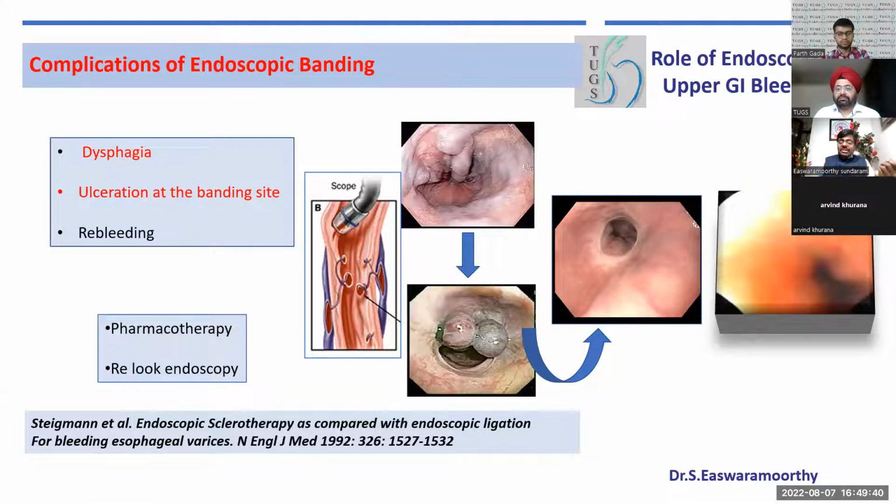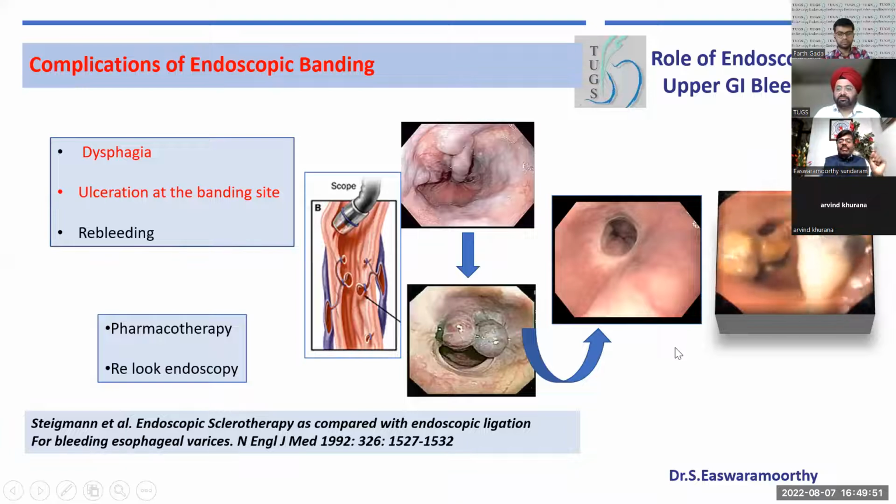Even the patients ask, sometimes GPs ask, they have to know: after 48 hours, the bands slough off. Okay, so this is just a video clip we have taken 3 days after banding. This is what the bands look like. You can see that the area becomes necrosed, then sometimes sloughs off.